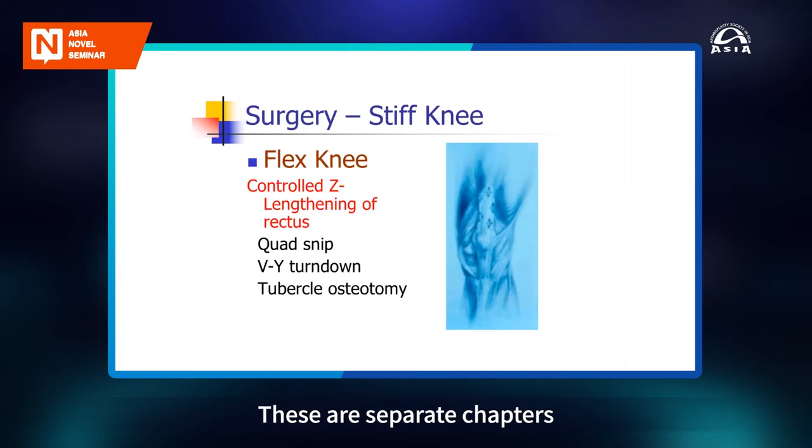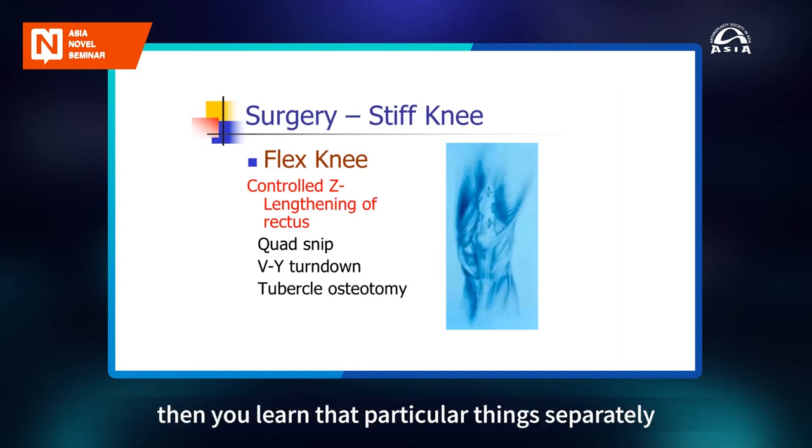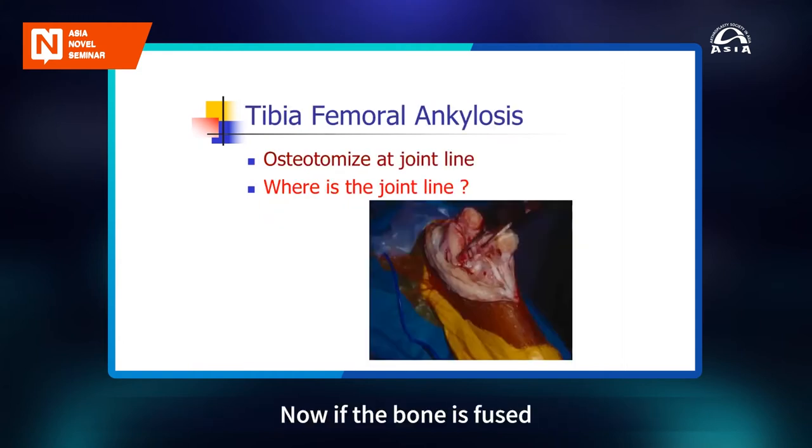These are separate chapters, but you have to know, the young colleagues have to know what are the possibilities. And if you're doing something, then you learn that particular thing separately. Now, if the bone is fused, like the case we are dealing with, we need to break this fusion. How do we do that?